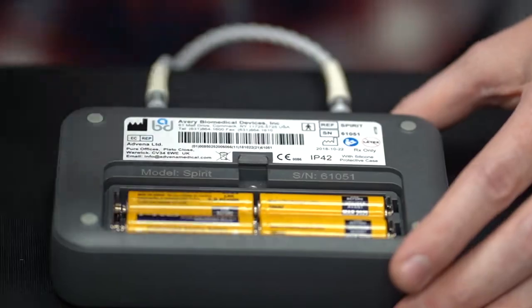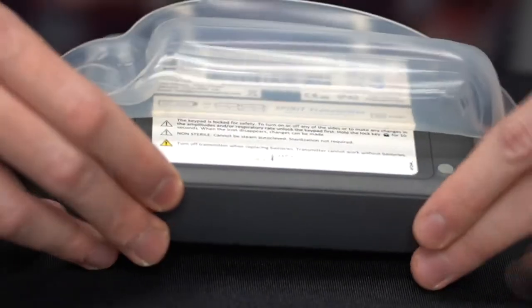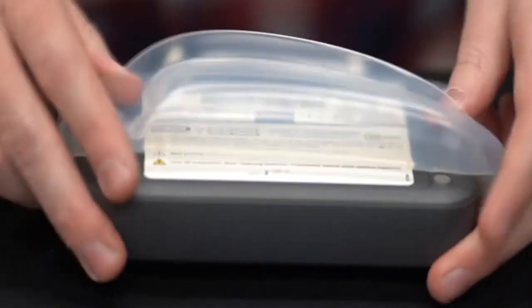The battery icon shows up to four bars depending on the charge level: battery charge between 75% and 100%; between 50% and 74%; between 25% and 49%; between 10% and 24%; and battery charge less than 10%. Once the batteries are inserted, you may now place the Spirit back into the silicone soft case.